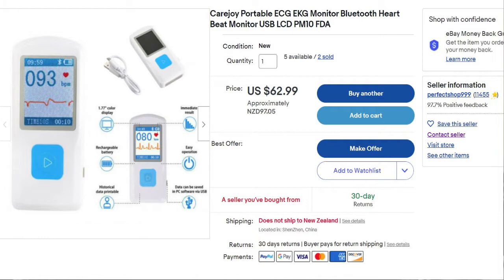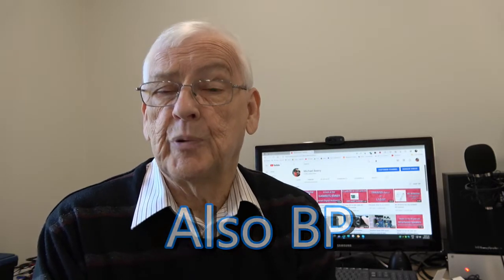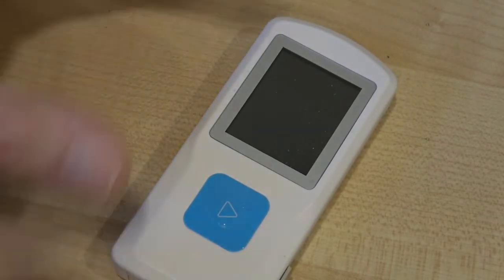Today's video is about this device, which is really a very simple but amazing machine. It's meant for domestic use and it's a portable ECG machine — it shows you the rhythm of your heart. There is a program you can put on your computer, and I've installed the software and I'll show you what it basically looks like. It's amazingly small.